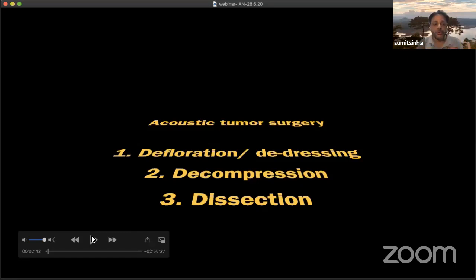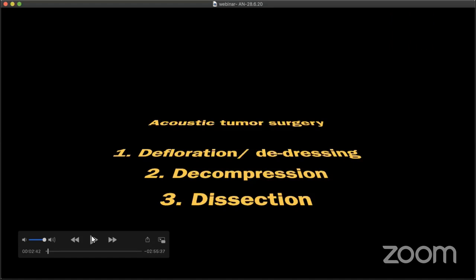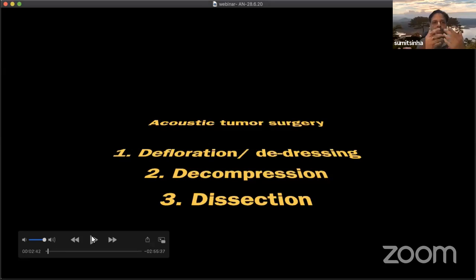As soon as you open the dura, you retract the cerebellum. You land onto the arachnoid membranes, stimulate it with a nerve stimulator, to find that sometimes the facial nerve travels posterior to the tumor. So the first thing which you encounter is the facial nerve. After you have negated the presence of a facial nerve, you have to remove the arachnoid membranes over the tumor capsule slowly, and you have to de-dress the tumor. This procedure, I call it defloration.